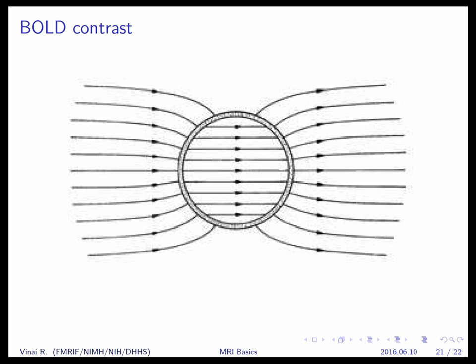And then the more vessels like this there are, the more you'll see the signal attenuation because in those voxels, there'll be more spins out of phase with one another. For the structural scans, the TE is way shorter than that. It's on the order of 3 or 4 milliseconds. And in that time, they don't have so much time to get out of phase with one another.